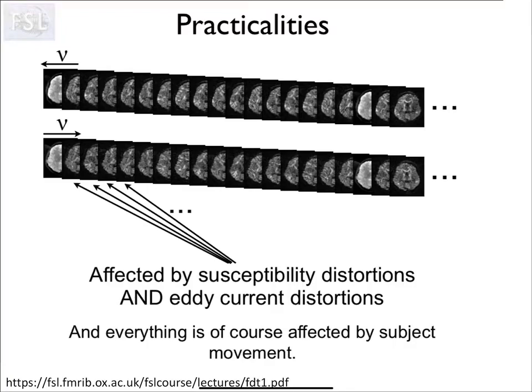And certainly we know from neuroanatomy that there are lots of fibers, and very tiny ones that we may not even be able to pick up with MRI. But there is more work being done at going to higher resolution to try to pick up fibers, especially in areas that are mostly gray matter. Okay, so that is an emerging area, but it's not necessarily standard practice yet.